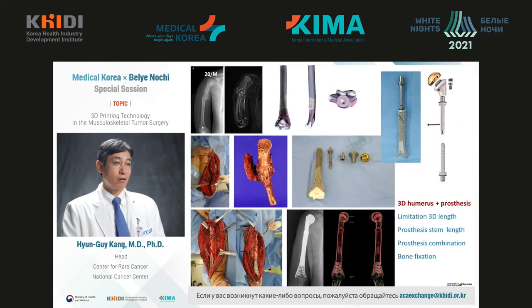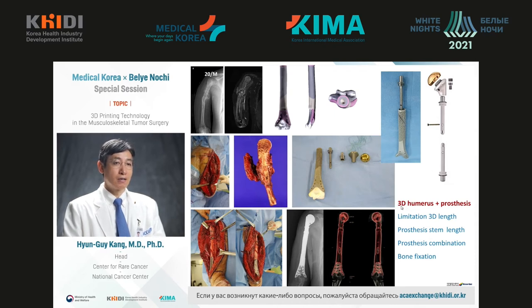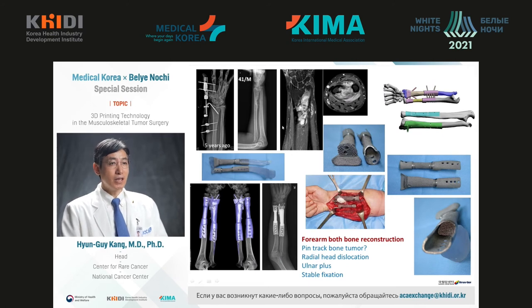Patient, 20 years of age, osteosarcoma. We needed to resect bone just above the elbow. It was hard to do the surgery because the resection should be done at the upper elbow part. So we printed a 3D shoulder bone, and then we could place the pin there. We managed to reconstruct the bone of the advanced tumor process using 3D printing of the shoulder bone.